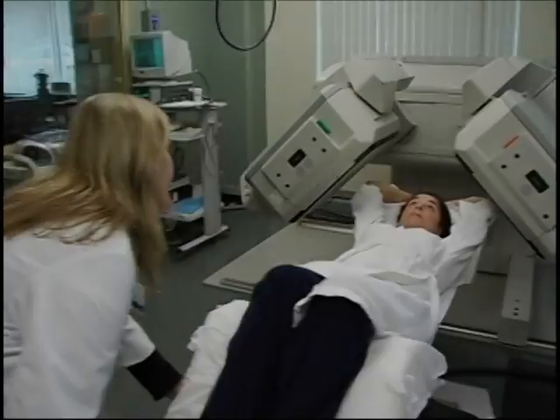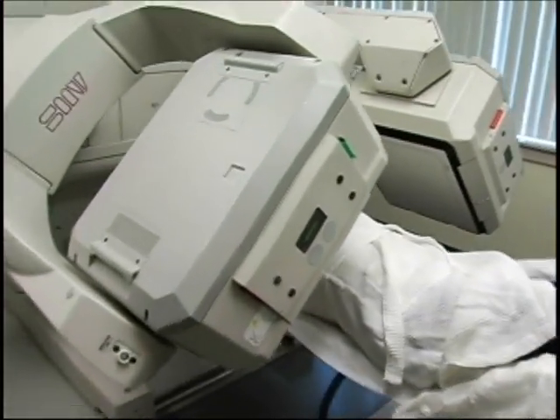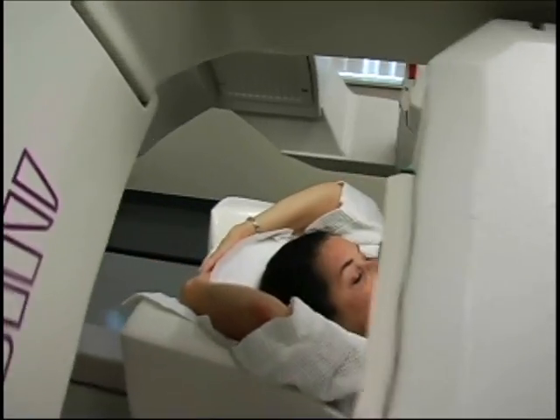The stress images are identical to the resting images; however, a heart monitor will be connected during the 15 to 20 minute scan.